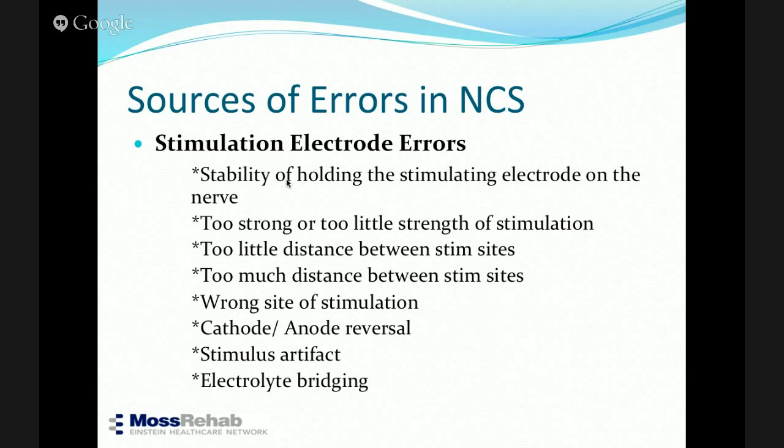That's why you are always asked to roll back once you go supramaximal, because your latency is going to change, right?